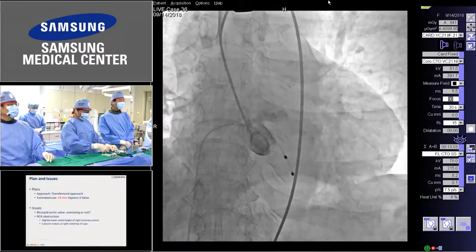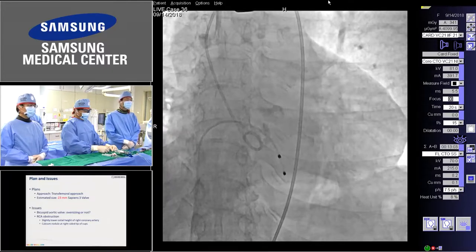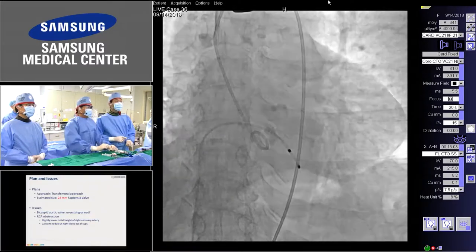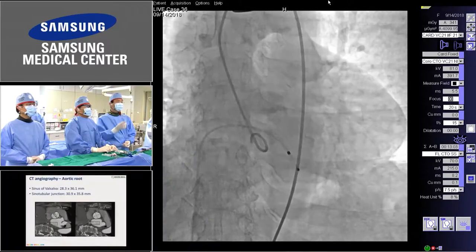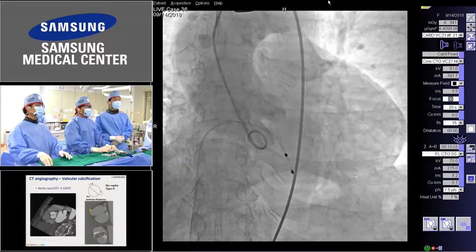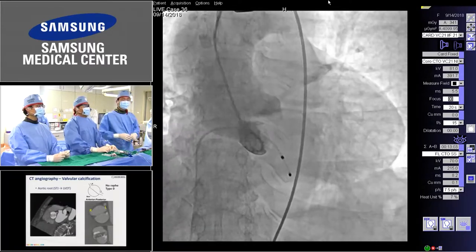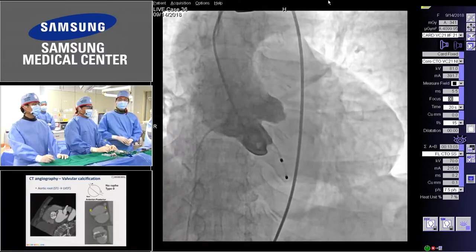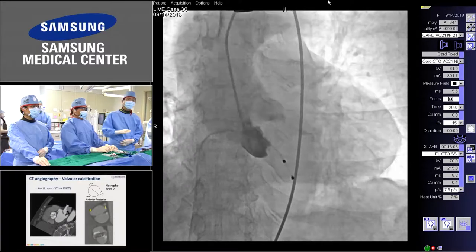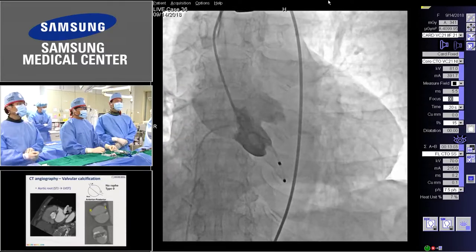Any other comment? I just had a short question. I wonder whether the measurement was at the annulus height or higher than that. That's the major discussion point for this patient, actually. We have not experienced many bicuspid valves, but when I deployed the Sapien valve, we prepared the full size measurement of the annulus. And when we do the CoreValve, the company told us to measure 4 millimeters and 8 millimeters above the annulus, and measure the intercommissural distance, and the sizing is based on that measurement.